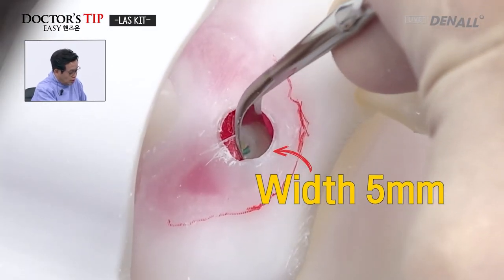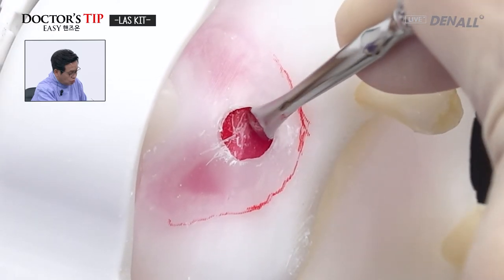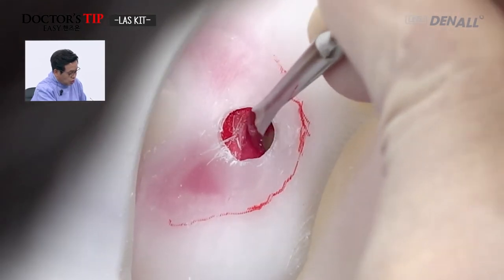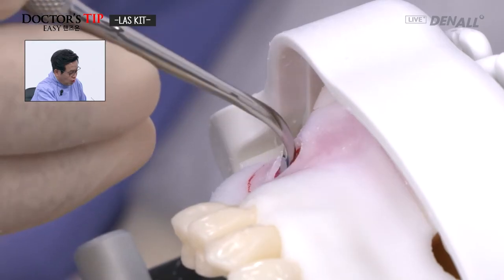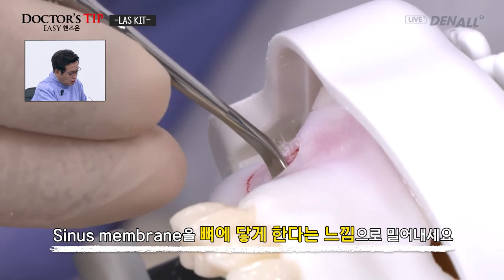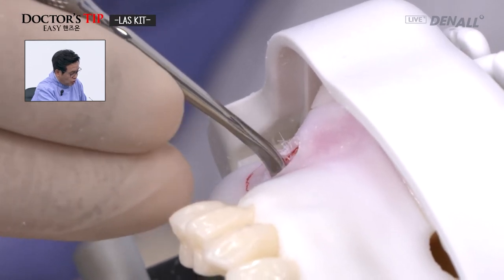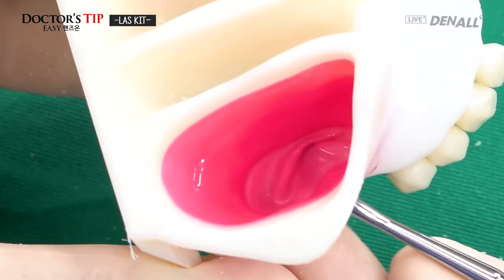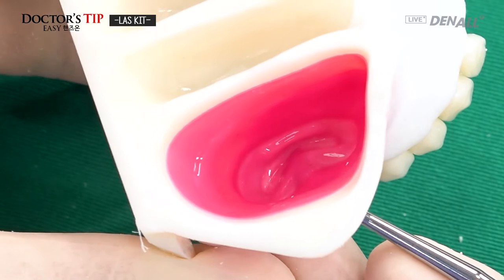Depending on your preference, the part you go first is different, but I think this top part might be the easiest. And if necessary, the mesial area is then detached, because that is a very thin one. So in the clinical setting, if you elevate the sinus membrane, it's easy to tear. So you let the membrane touch the bone and push it, then the sinus membrane can be easily detached and elevated. So like this, even on the deep side, even to the nose lateral wall side, you need to fully detach so that there could be wider elevation.